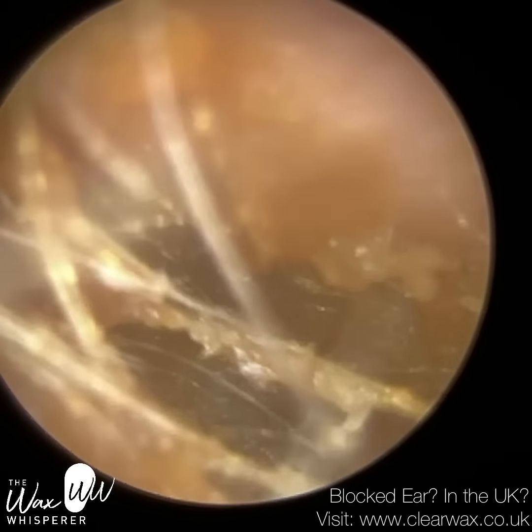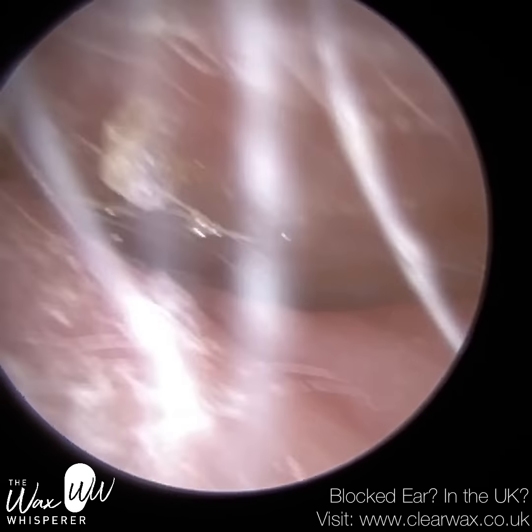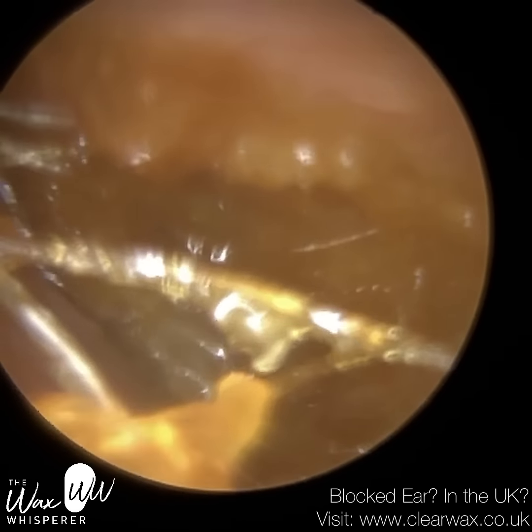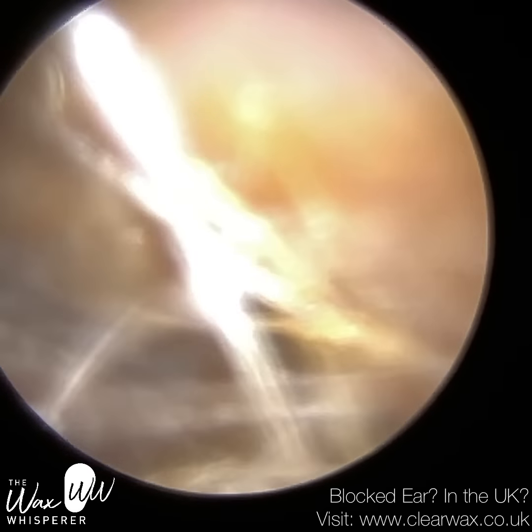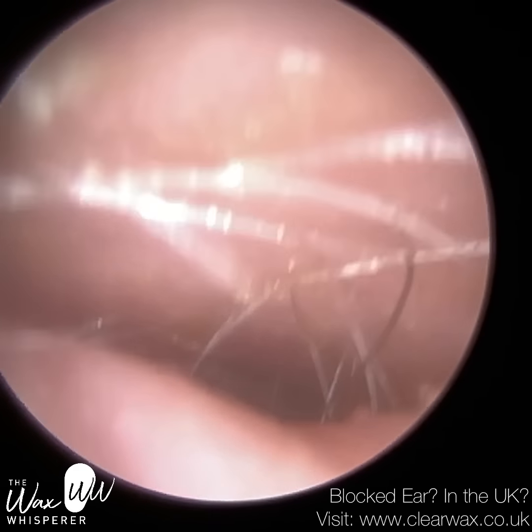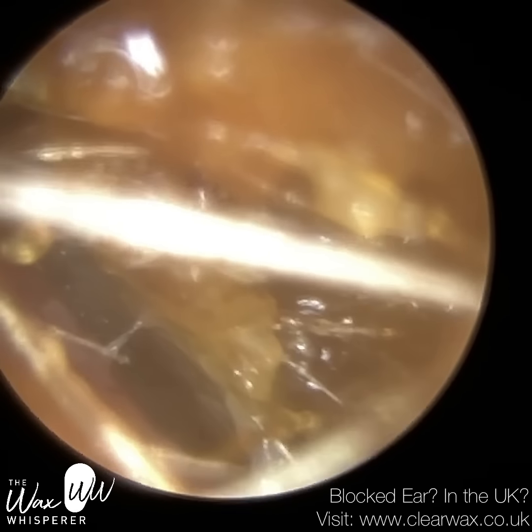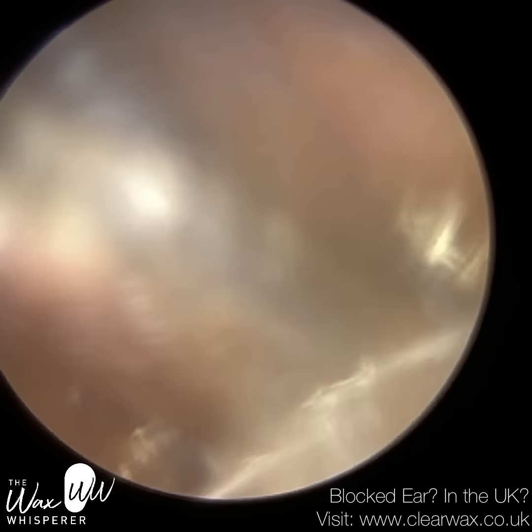I'm going to have to instil some olive oil earwax spray in a moment to change the consistency of this wax — I think I've just done it here. Without this, it's going to be very difficult to suction. I can't really use any other instrument; the Jobson Horne wasn't very effective at removing this occlusion, and it's just too soft for forceps or an earhook. I'm hoping the olive oil spray will help bind the wax together so when I do suction it, it comes out in larger pieces.